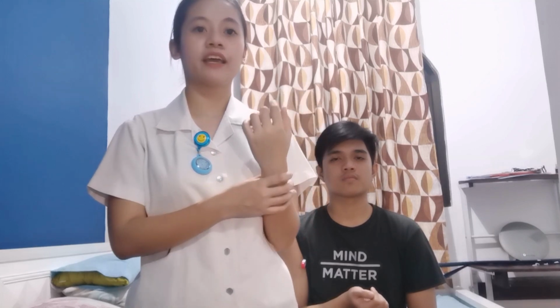In getting the pulse and respiration, the first step, while waiting for the thermometer to read, is to place the patient's hand on the abdomen while holding the wrist, palms down, using the pads of the 3 middle fingers on the radial artery. Do not use the thumb because the thumb has its own pulse, to avoid wrong measurement.